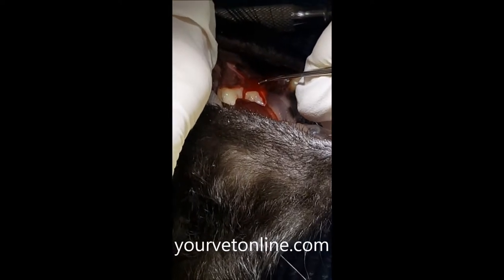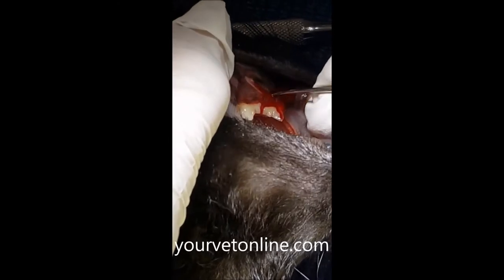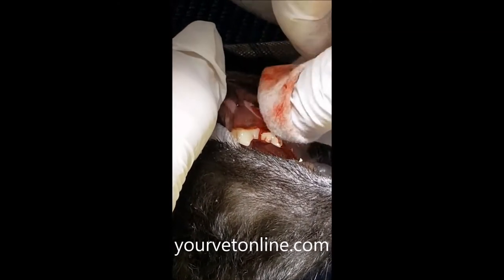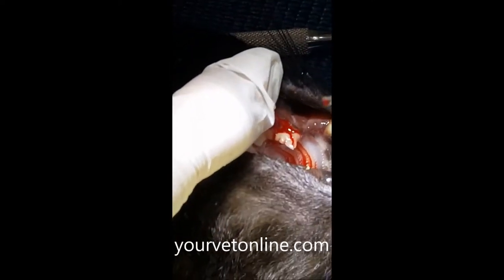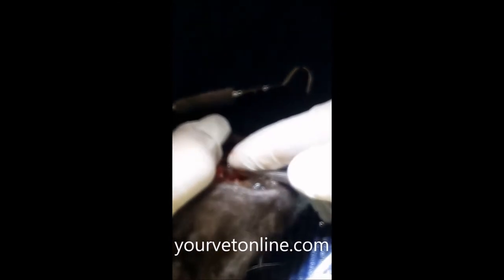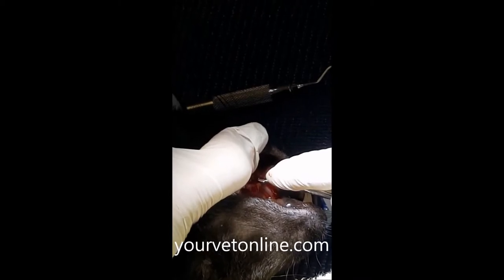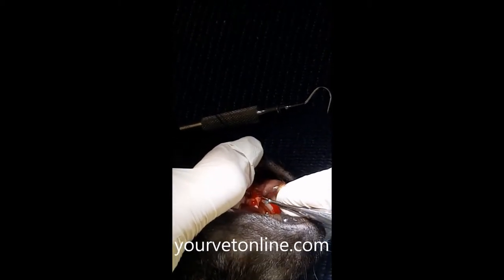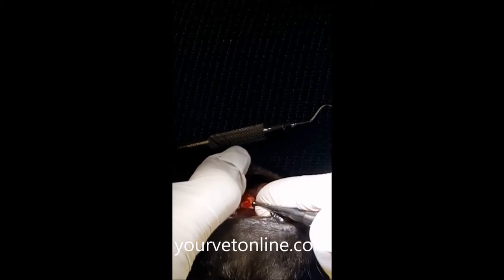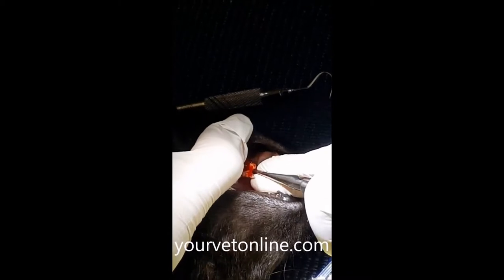Now what we're doing is we're using a sharp dental elevator. This is inserted between the socket and the root, and what we're doing is we're breaking down those ligaments that are holding the tooth in place in that gum socket area. So we give it a good little wiggle, placing a lot of tension and torque and torsion on that tooth, hoping that these ligaments break down and allow us to pull that root from the socket.